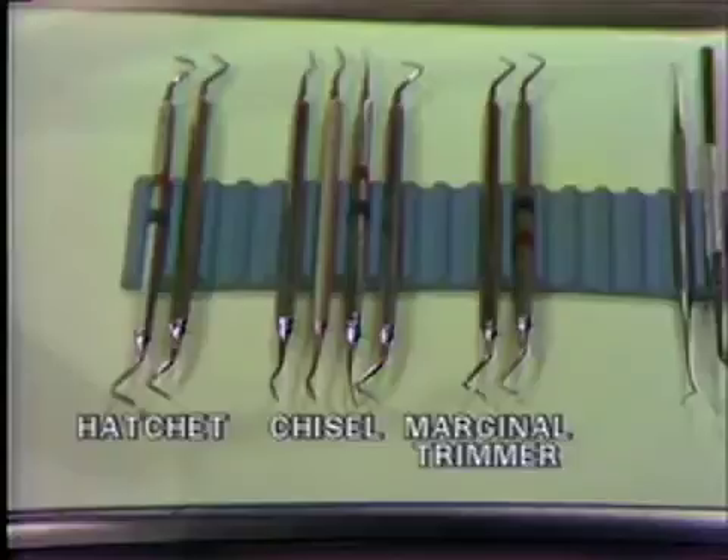On the tray, we have an assortment of enamel hatchets, chisels, and marginal trimmers.